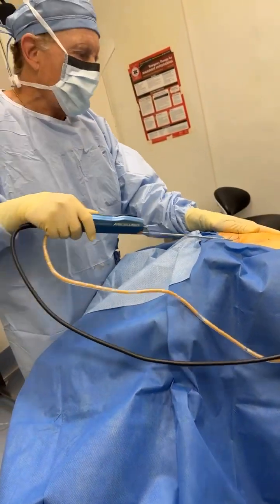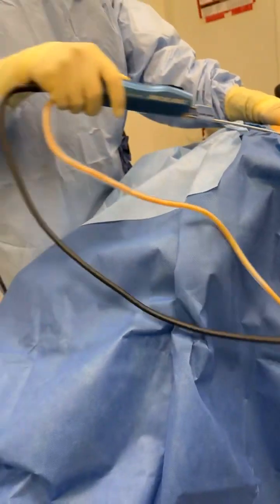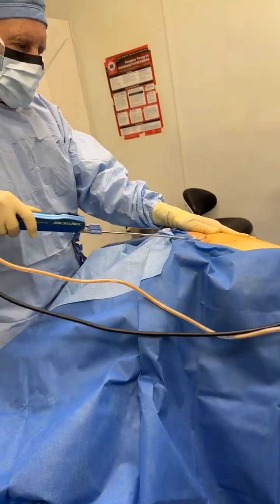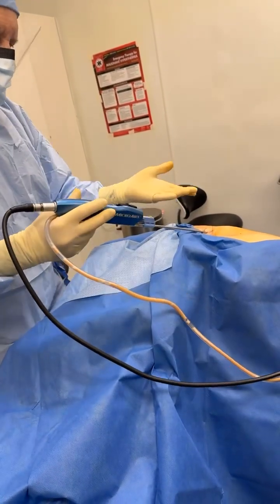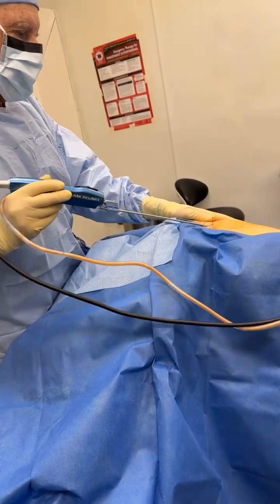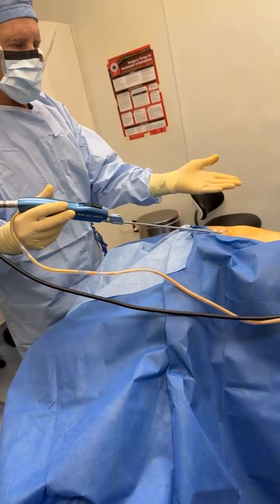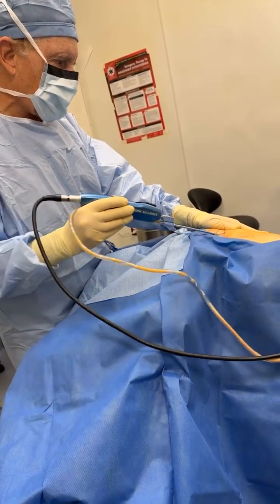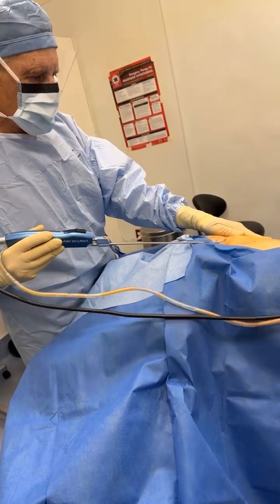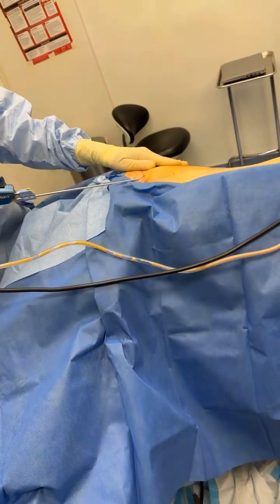And that way you can also obtain this beautiful yellow aspirate, because it's similar to brushing your teeth, right? If you brush your teeth at full speed with a regular toothbrush, there is going to be gum bleeding, right? But if you brush your teeth with an electrical tool, and just look, I can hold it with 2 fingers like this, and it slides in nice and easy without any significant pressure. So this has many benefits for the patient, of course, because there is less risk of anemia, less risk of bleeding, less risk of infection, less risk of oil cysts that are the result of traumatic, aggressive liposuction, where basically the surgeon breaks the fat.